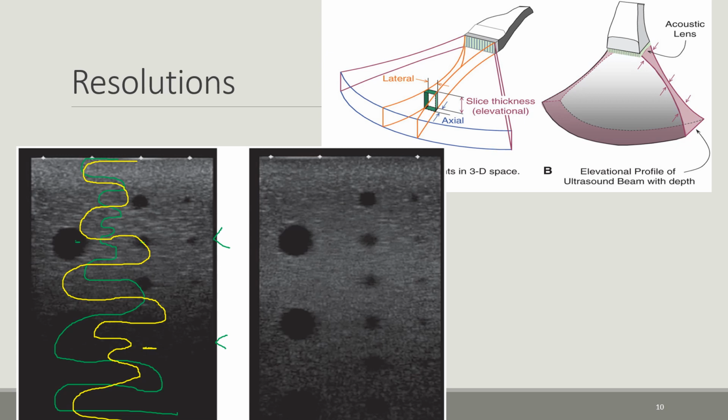Now finally, I was going to talk about elevational resolution. Elevational resolution, if we look at this transducer here, we see that while we look at our image as if they're a finite, a very, very thin laser slice of the body, they really aren't. All of our transducers, as you guys are scanning, you see are really usually formed as almost like a matrix across the face of your transducer. So what you're really doing is you're collecting a layer of information, putting it over another layer of information, over another and over another, and then basically stacking them and creating one two-dimensional image.